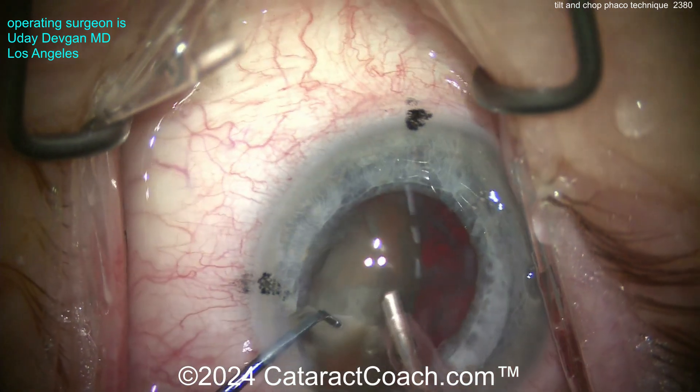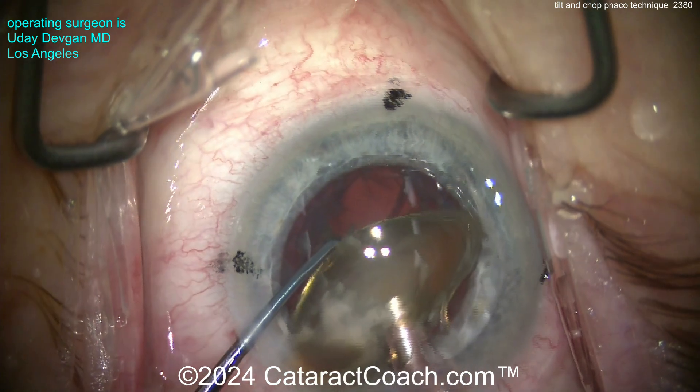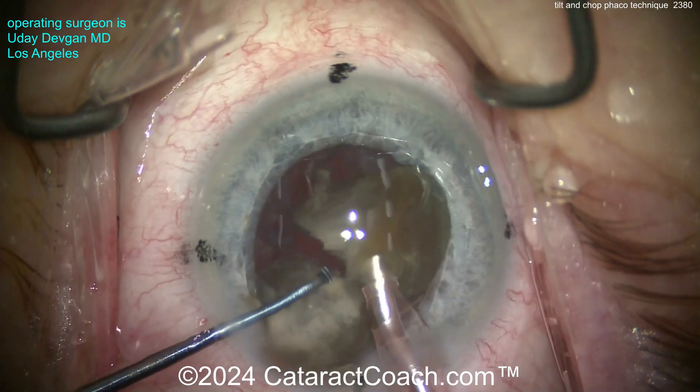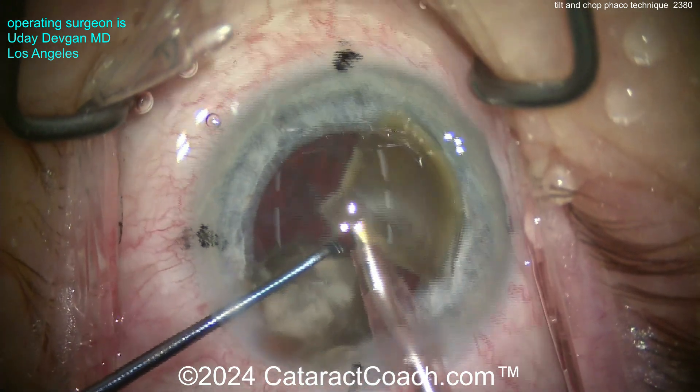Now you can buzz into the nuclear pieces, the chopper comes in again, and we can chop this quite easily. There it is — separating the pieces. Now you have two quadrants, and once you've separated the quadrants you can emulsify them. Notice that we're doing the phaco at about the iris plane.